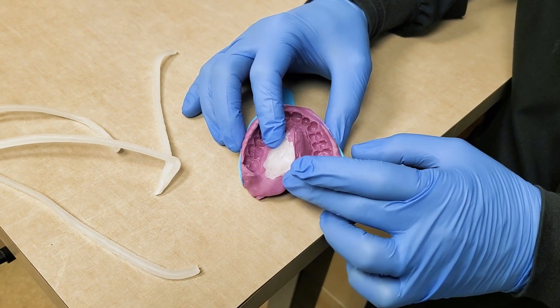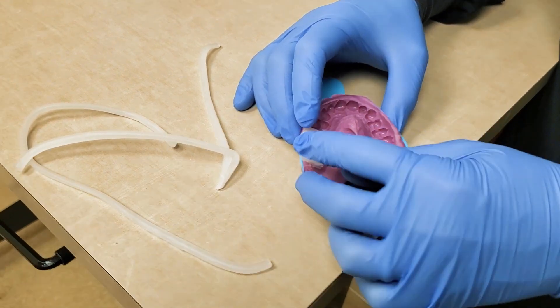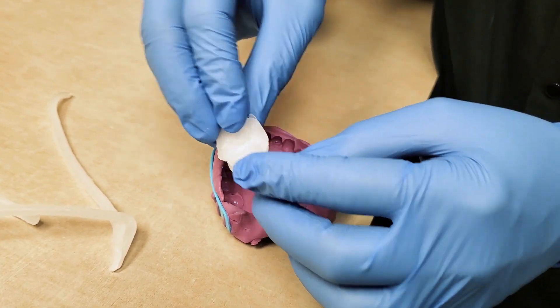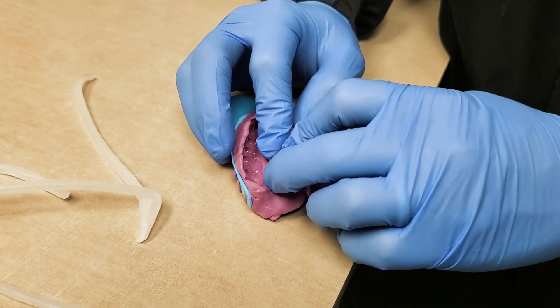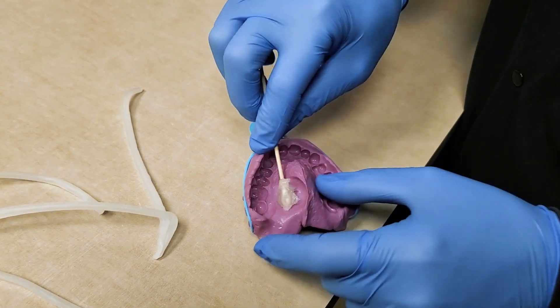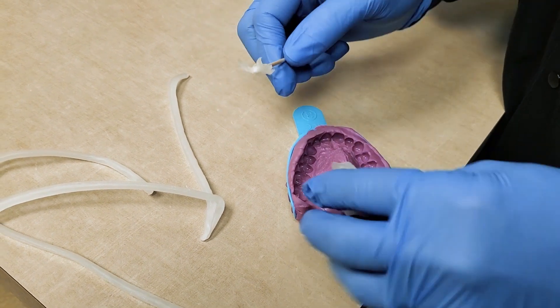We took a portion to find out exactly what it is, so that we know the surgical approach to remove the rest of it in entirety. He was awake for this procedure and will be asleep for the next procedure. This is what the piece of wax looks like — it gives you a feel for what the defect will look like in the future. It kind of sits in like this, and then we'll use some vaseline to create a little suction on the inside to help it stay somewhat still.